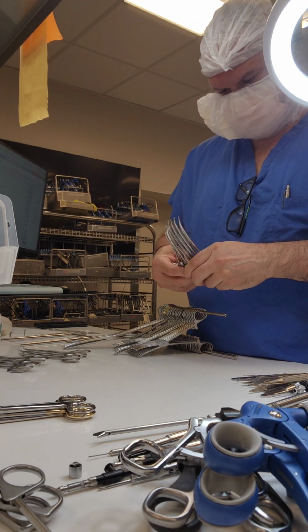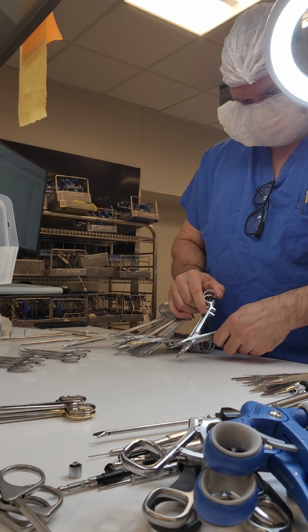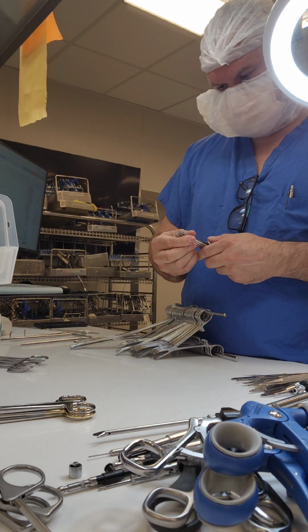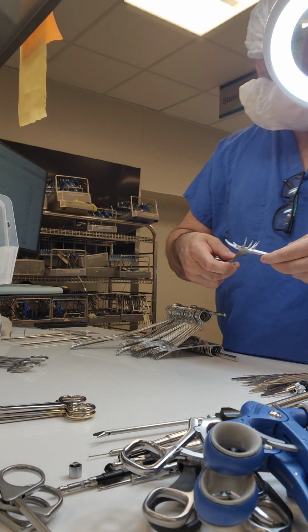I can't leave them closed. That takes time as well. Okay, and this gets faster, it does. I'm not saying that this is such a slow motion and we don't need to do this. No, we should do this on every instrument, every tray.